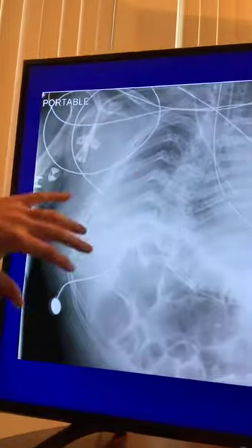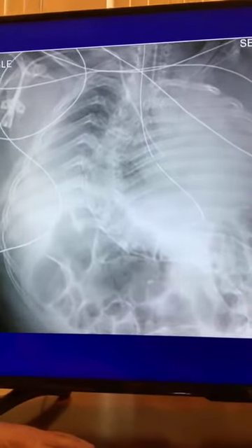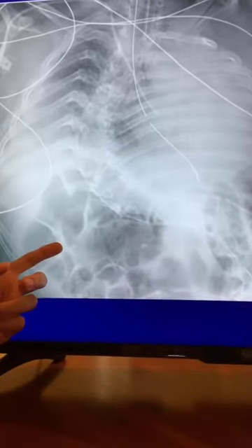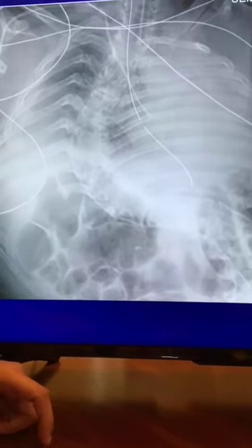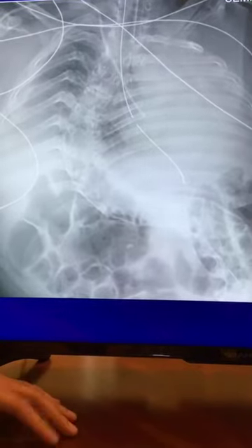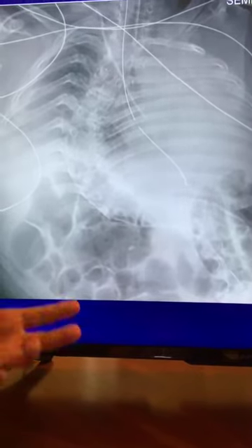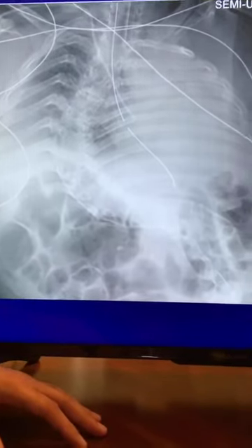Kind of the same thing over here. So again, this scoliotic spine right here, it's pretty annoying. Some of you guys may ask about this bowel. Is this normal? You may be concerned about a bowel obstruction. Honestly, we see this kind of bowel all the time, especially in ICU patients. Their peristalsis doesn't work that well, their gut is not moving as it should be. So a lot of them have an ileus sitting in the ICU.